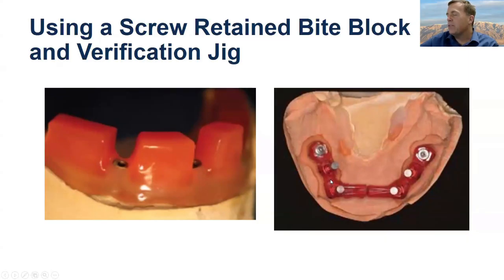If it doesn't seat passively, cut both sides of the problematic implant, lute it all together with a low expansion resin, something like GC pattern resin, and then protect it and send it back to your laboratory. I always say if it's one, cut it. If it's two, take a new impression, because you get to the point where you don't know which is good and which isn't. So help yourself out with that.